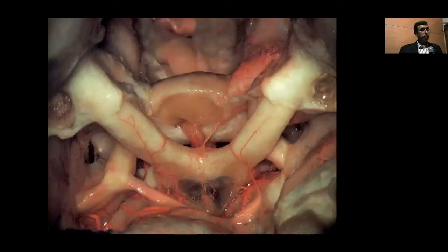These tiny little vessels, very tenacious. Beautiful picture. But imagine people do brain surgery without microscope, and patient gets blind because they don't see these vessels. And when they say neurosurgery is microscopic, they say this is microscopic for old age, and we are young, we can see well. You cannot see these vessels. And we were trained like youngsters on microscope. So that's how people would be blind because of this thing.